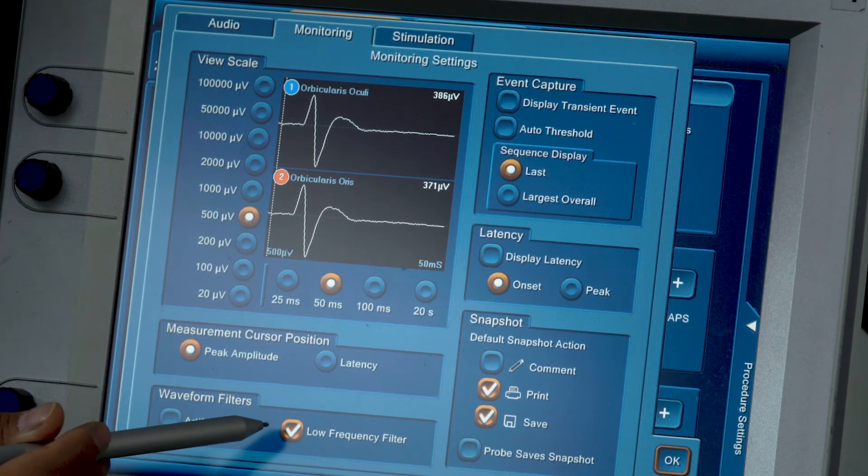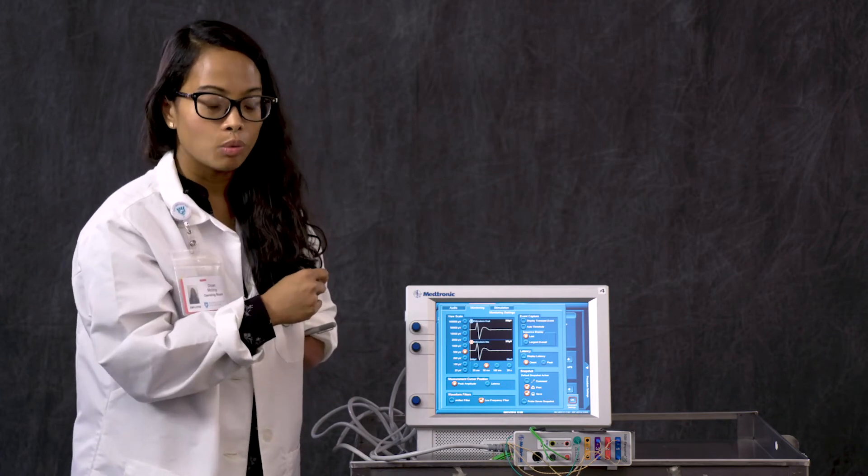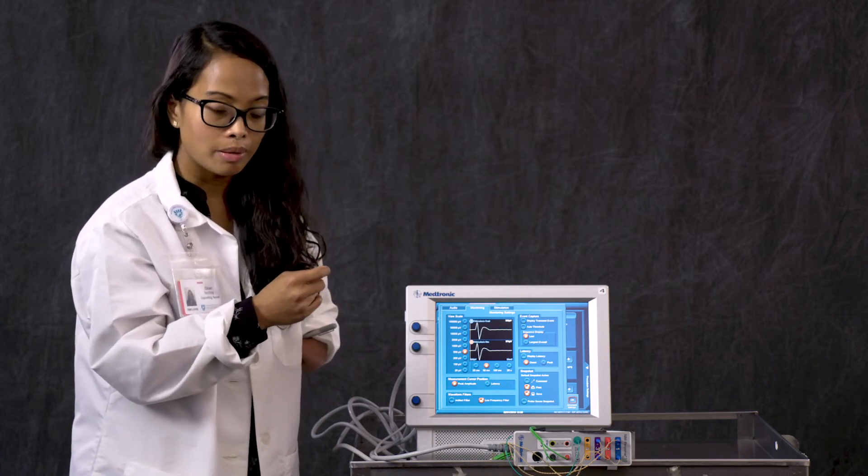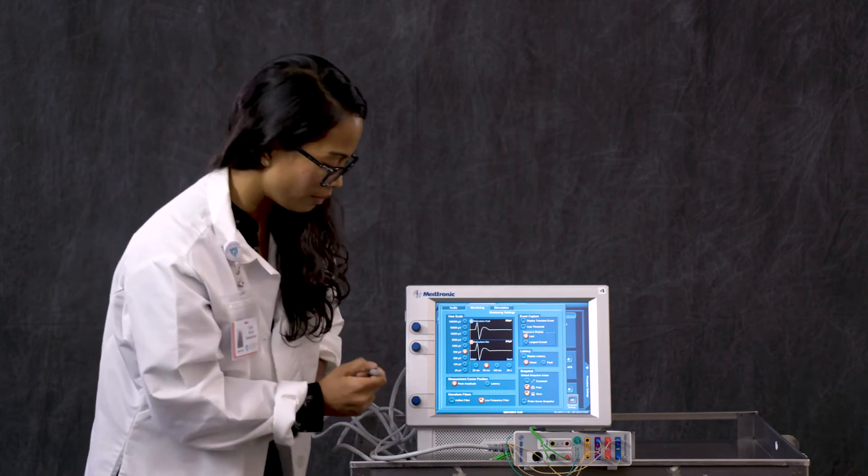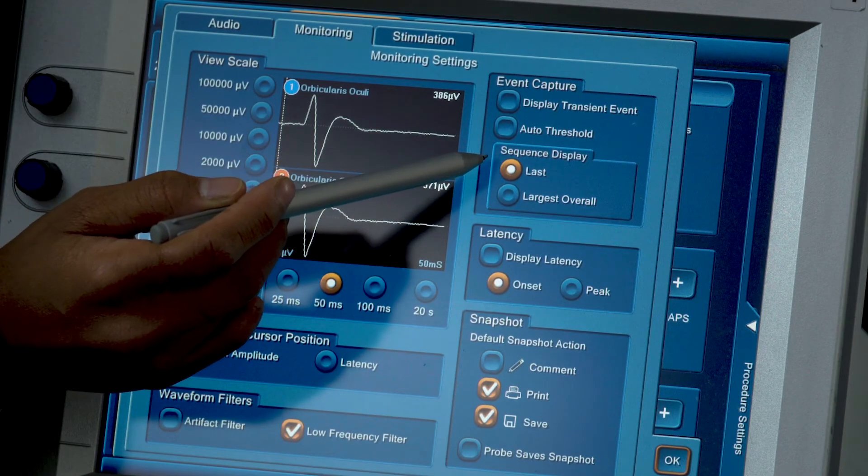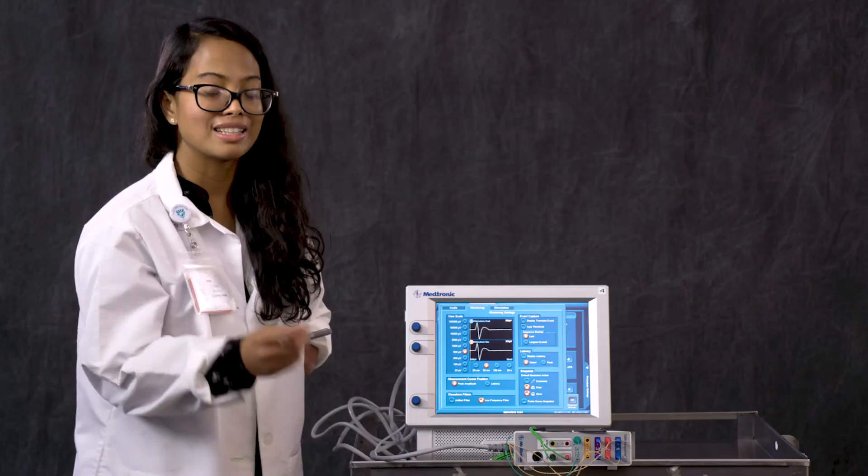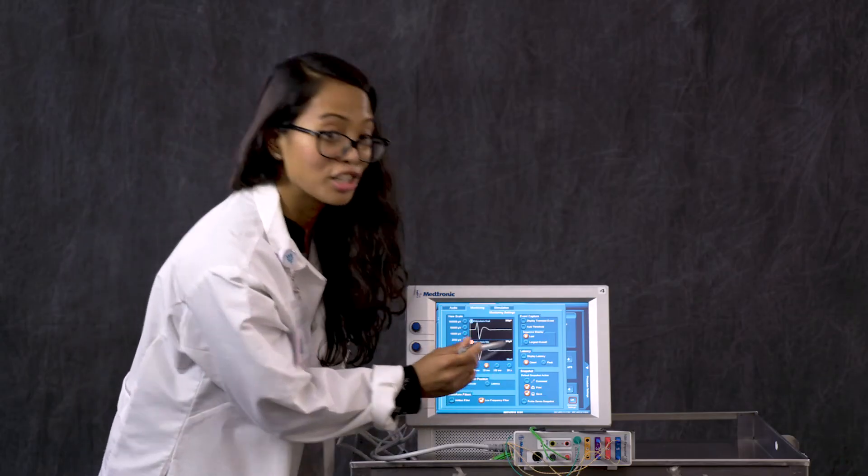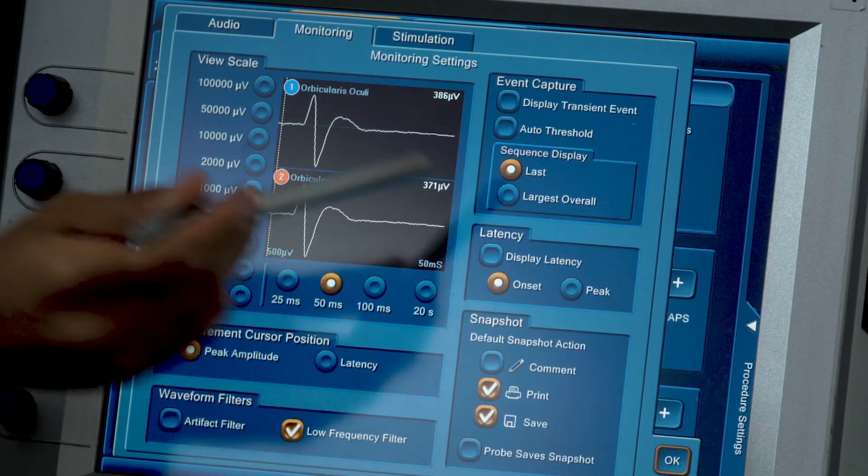For the waveform filter, we have low frequency filter. All this means is that when you're putting the electrodes in, there will be rubbing against the skin, tissue, anything like that. This is on as a filter to stop any of that. Going forward, we are under sequence display. The way that the information is being displayed with your EMG monitoring, it is the last thing that you've seen. It's not the largest overall EMG wave. So we have picked the last thing that you've seen.